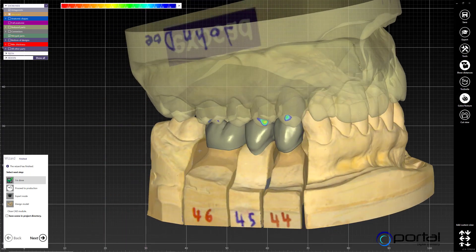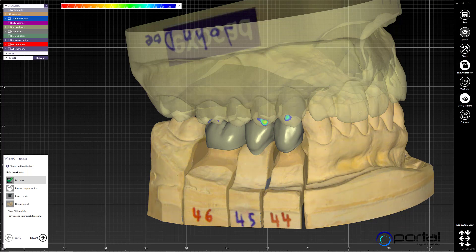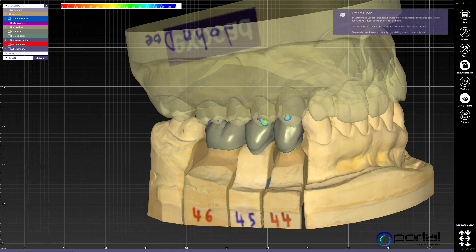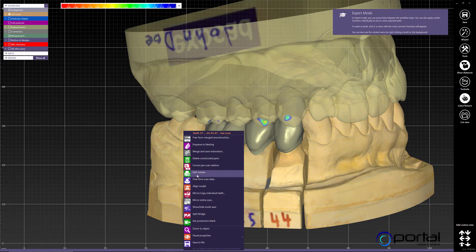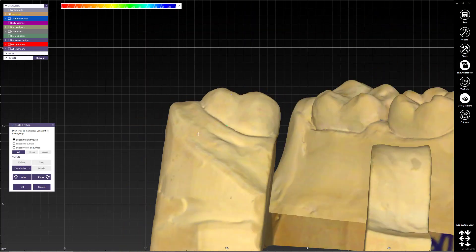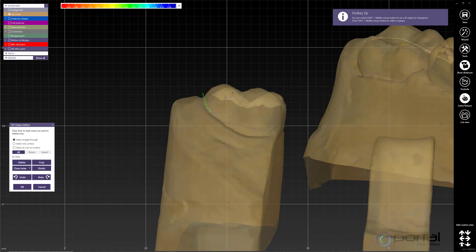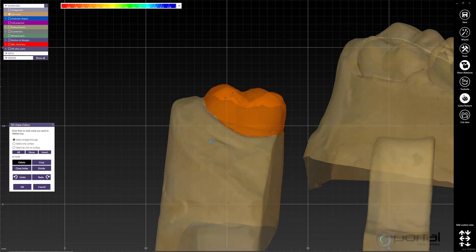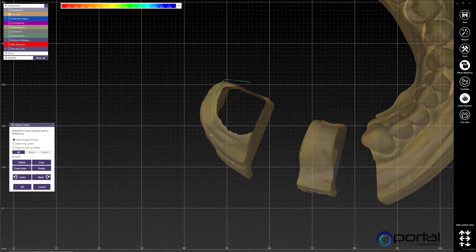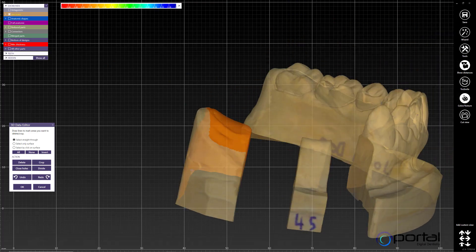I can do this without having to start my design over. The first thing I'll do is go to expert mode, edit my scan data with the mesh, and then extract this tooth. This is one way of doing extractions — it's not too accurate, but it gets the job done.